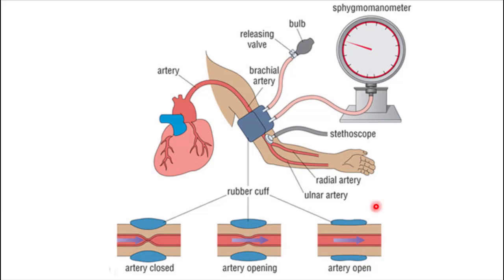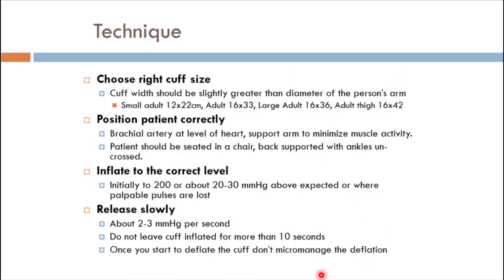So that's what's tricky about this whole setup, is that you're trying to time it so this releases at a slow enough pace, but not too slow. You're listening, and you're trying to correlate the onset and reduction of the sounds based on what you see on the valve. So a lot going on. It is a simple process and simple mechanics and simple thought process behind it, but it does just take a little bit to get used to.